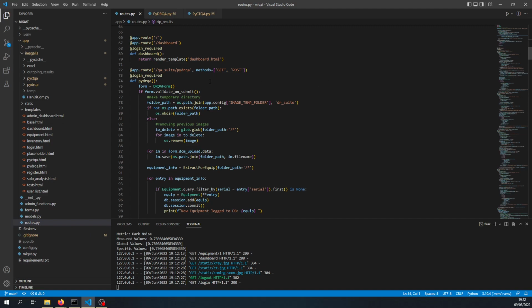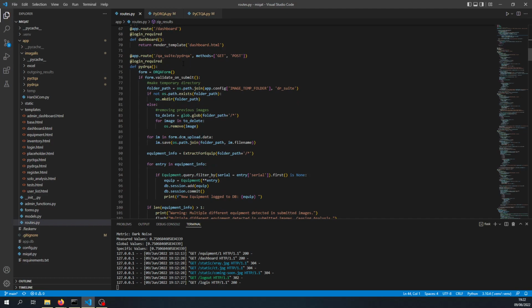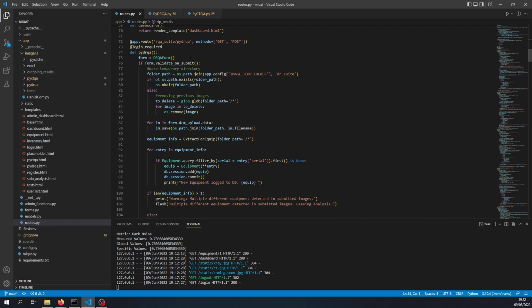Just as a quick run through, we'll look at the background of how the DRQA tests go before we have a look at it in the front end. Once the user navigates to the correct URL, it will go through the Python logic, which in this case also requires the user to be logged in, and we'll serve them a form. If that form validates on submission, which means the user has to have submitted the right types of data, this helps prevent users from accidentally inputting incorrect data, which could corrupt the database or whatever.